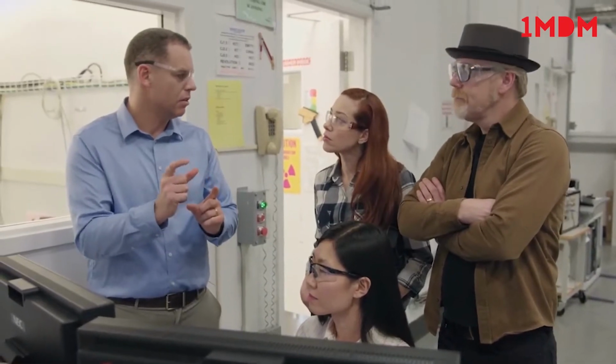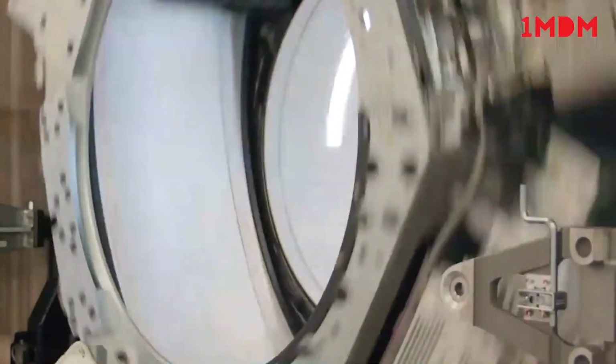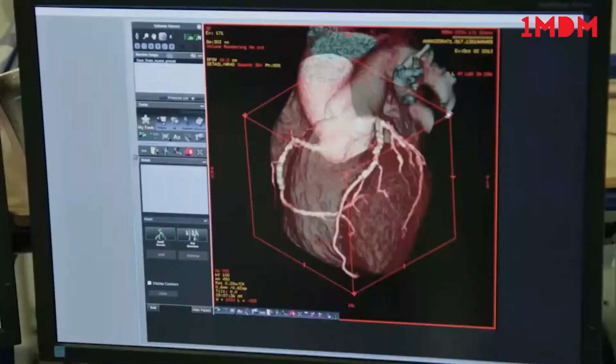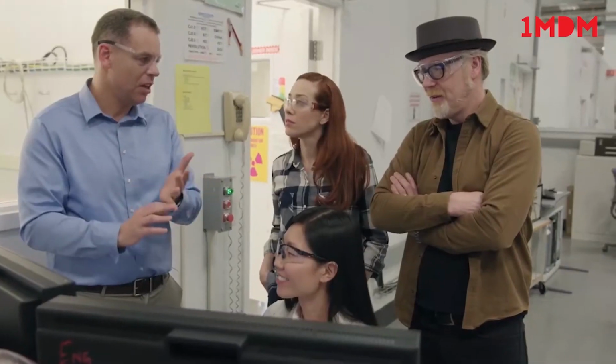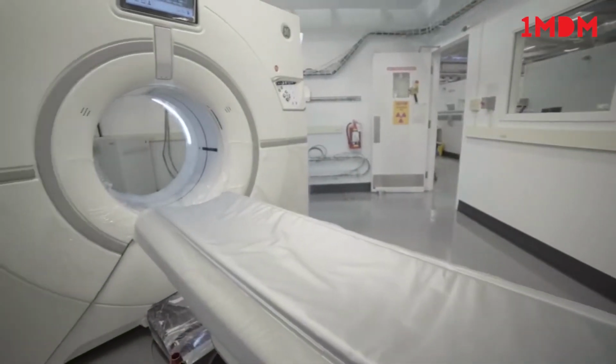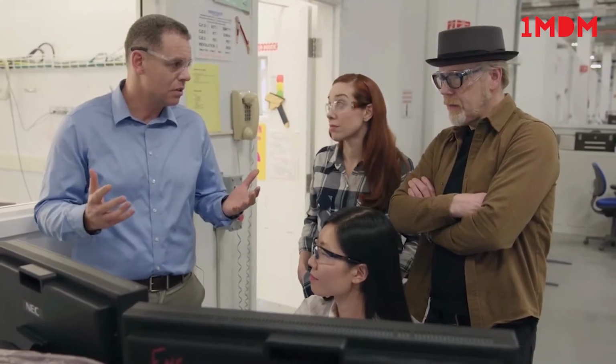Previously, because you had a small detector, you had to rotate so many times, you could have had good image quality, but you'd lose temporal resolution. Or on the other hand, you could have a fast scan, so you could get that temporal resolution, but your image quality would be poor. So you always had to sacrifice something. Whereas now, because we've got such wide coverage, trying to take 1,000 images 4 times a second, the trade-offs are gone. So you've got image resolution, temporal resolution, and detector coverage all on the same machine. So it's been a real step forward in that sense. So what does this mean for a patient? Right, well, this means less time on the table, less radiation dose. Their image quality is better, so it might mean the difference between diagnosing something and not.